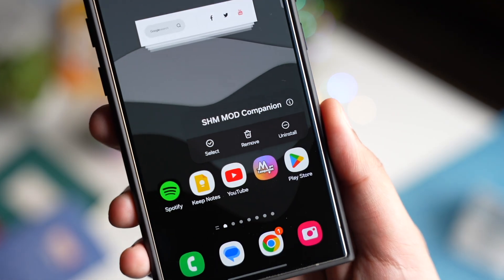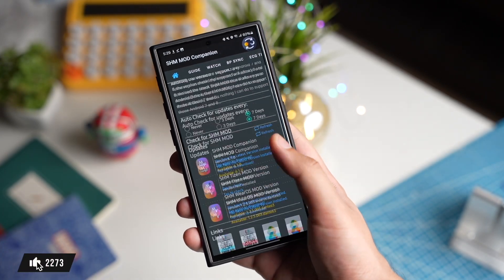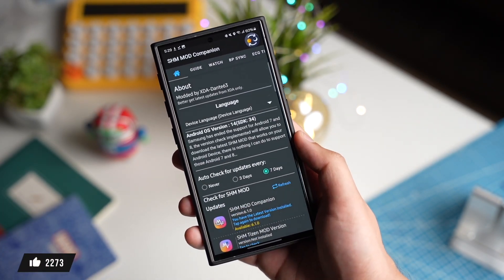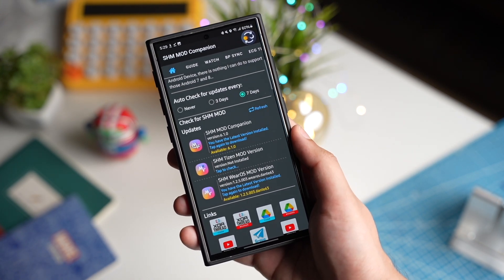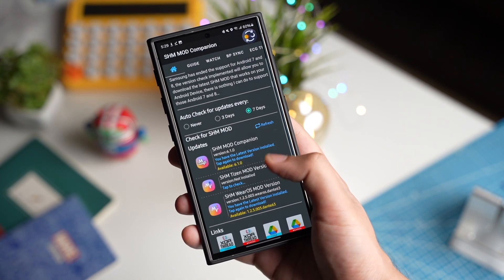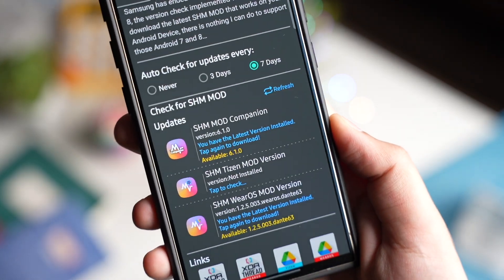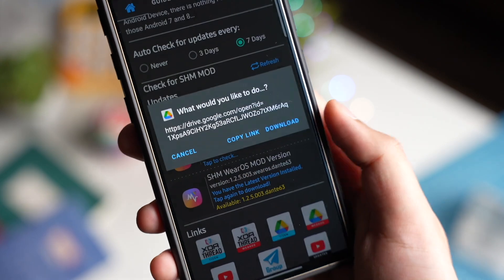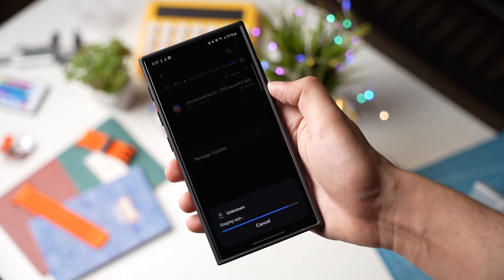Once downloaded, just install this SHM Mod Companion app — it will have this kind of interface. Under the home section you will see these files. This is to check for any updates for the companion app you already have downloaded. Next, this is the SHM Mod phone app that has to be installed on your phone. Just download and install this app on your Galaxy phone.